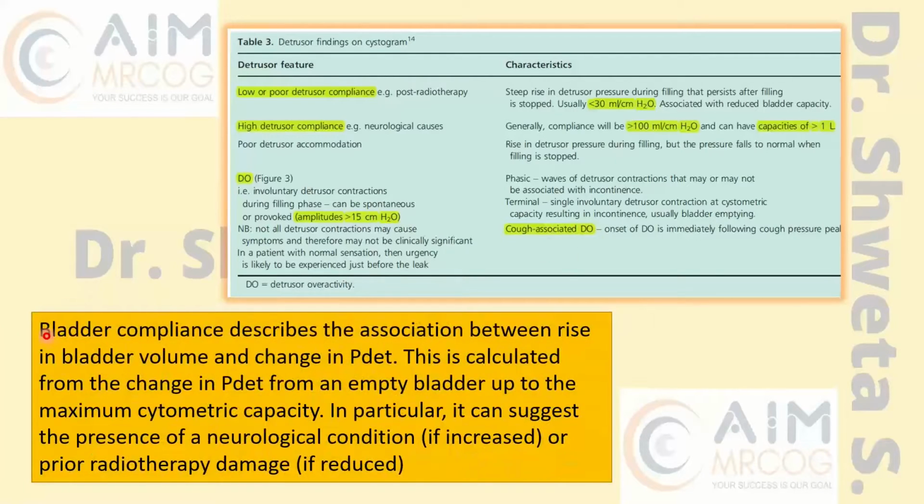This is all bladder compliance we have understood. So this is all about bladder compliance, that is the change in pressure with change in the volume of the bladder.